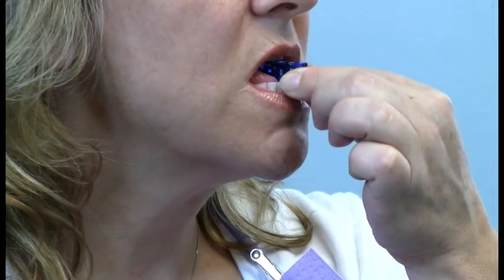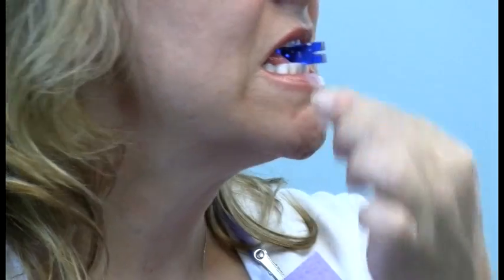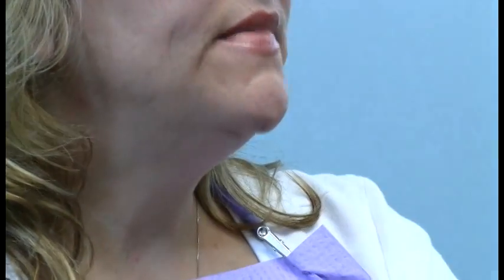Okay, now why don't you put that back in again, but put your upper incisors in the first notch. And now you are 4 millimeters anterior at 8 millimeters. That would be the same, okay, but less uncomfortable. Not comfortable. Okay. So the end-to-end or 2 millimeters forward at 8 millimeters vertical or 6 millimeters vertical are both her better airways.